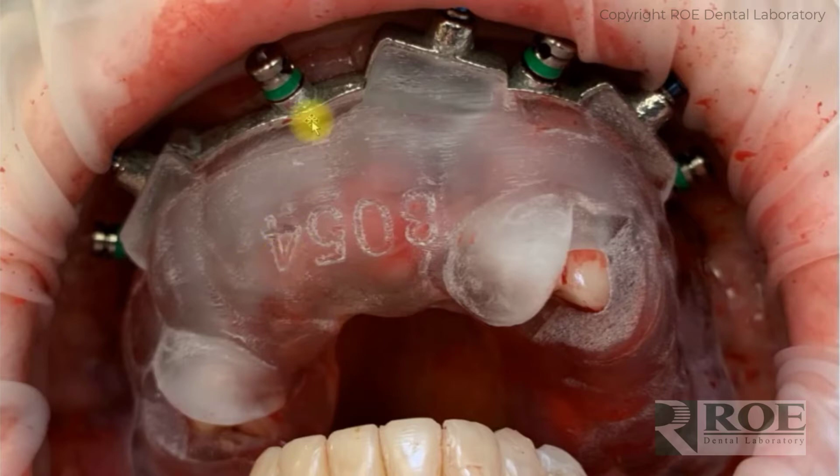So the pin guide delivers a fixation base, and they are connected. And you'll hold the pin guide firmly to the teeth and the tissue. Do not let this move during the entire pinning procedure. It's critical that the fixation base is set in exactly as it was planned. So you hold it in place, and you will simply drill one at a time using our special fixation base with step-down drills. So you'll drill, place a pin, tap, tap.